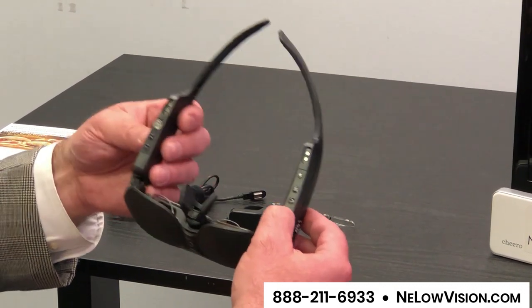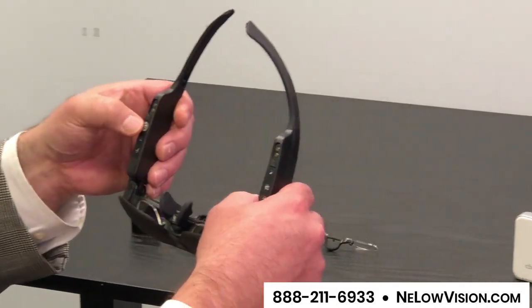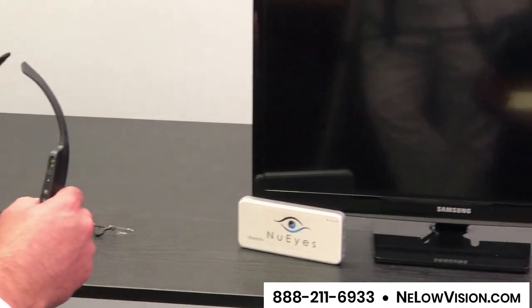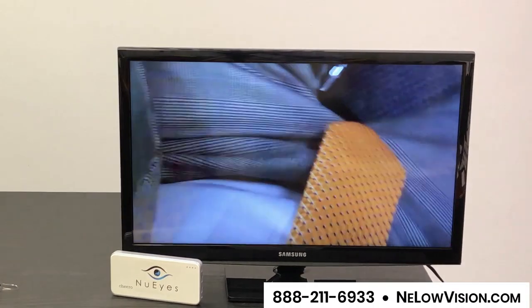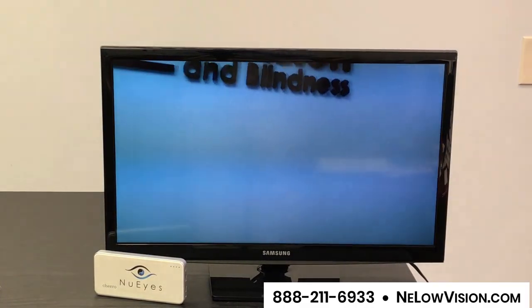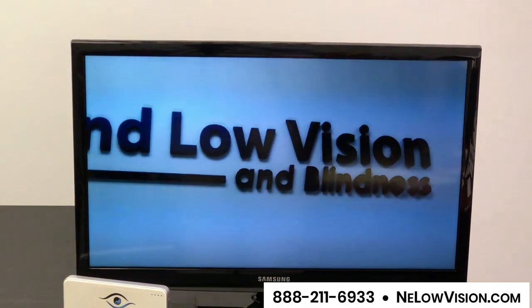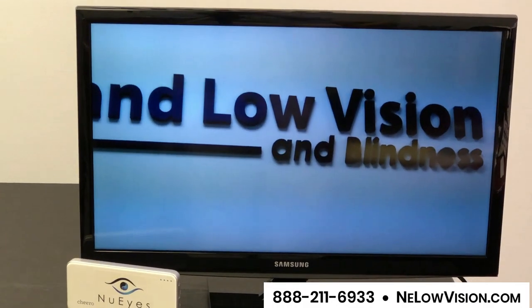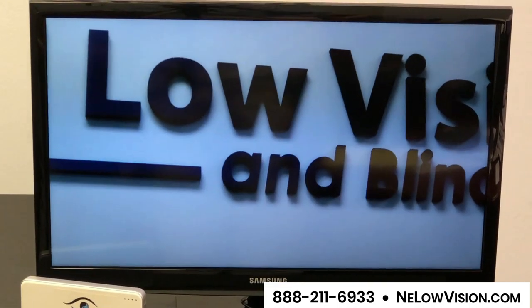So we'll put that on right now. What you'll see on the video is a monitor to my right, and everything that I'm going to be looking at with these glasses you'll see on the monitor. I mentioned before that you can control the magnification size by a button underneath, so we'll make the glasses bigger and make the glasses smaller.